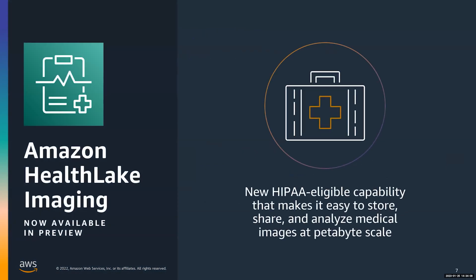So you will see during the demonstration that we made an integration both for MONAI Deploy on EC2 and MONAI Deploy on SageMaker with our new service called Amazon Healthlake Imaging. That means that the DICOM data that we are going to process is not stored in the MONAI Deploy server itself. It's not sent to the MONAI Informatics Gateway. It's directly picked up from the Healthlake Imaging data repository.